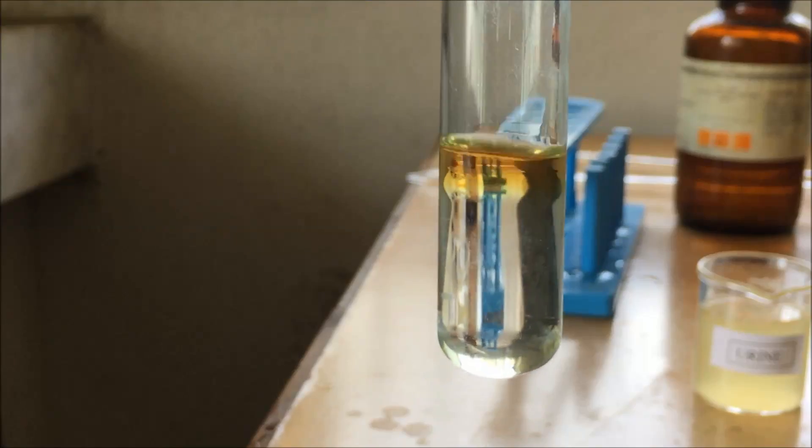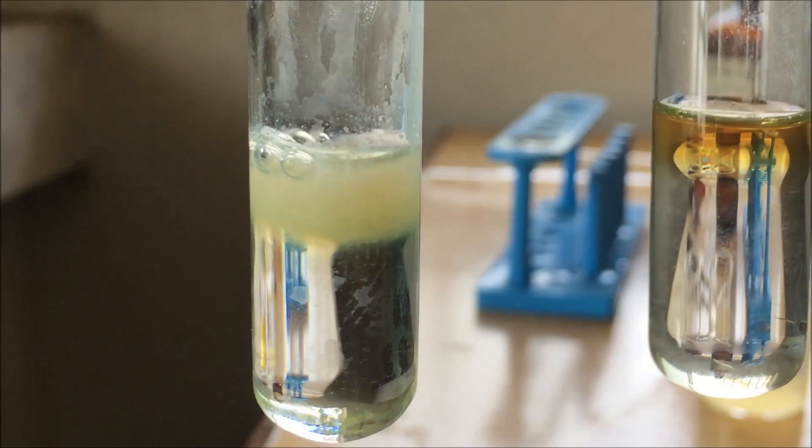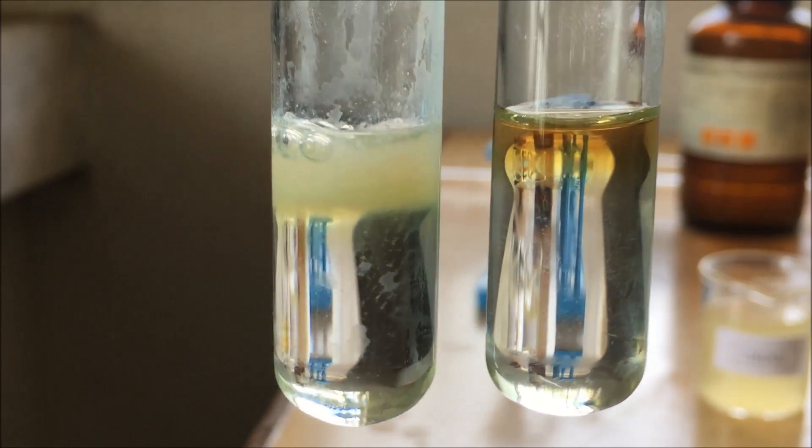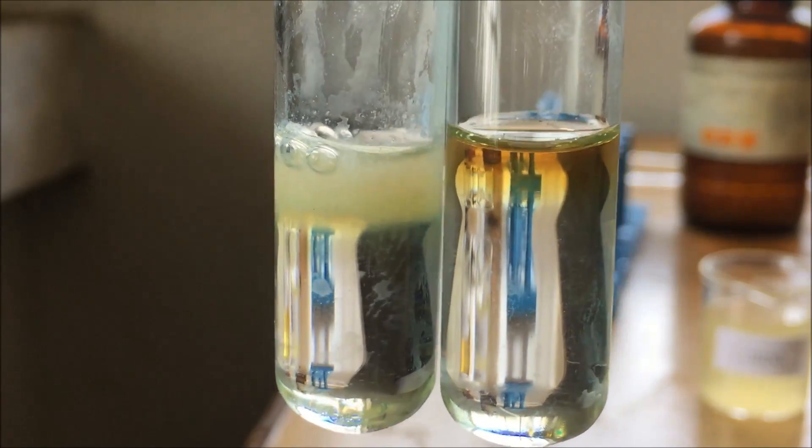Let us compare these two, the previous one and the present one. This was with a real urine sample and this is a dummy urine sample. It has a white precipitate ring.